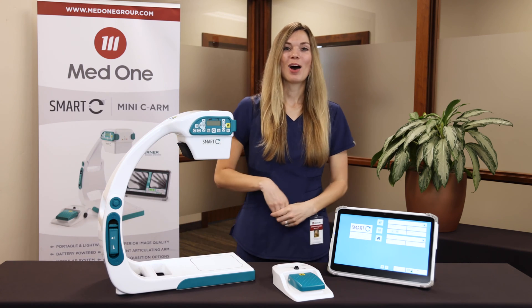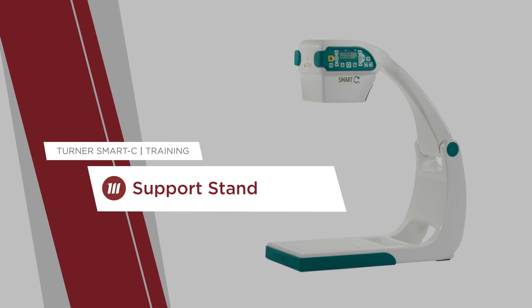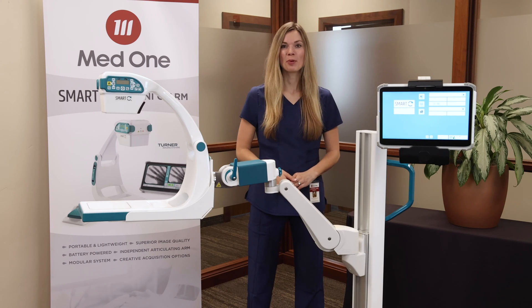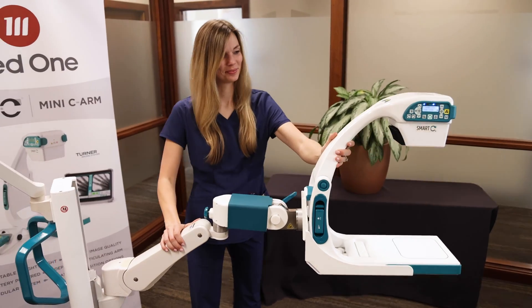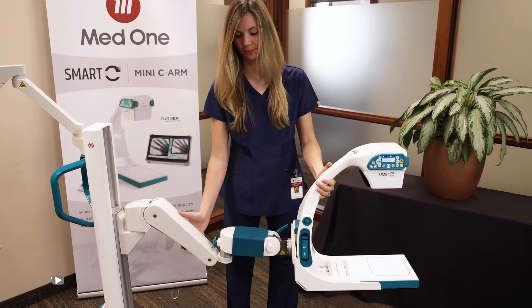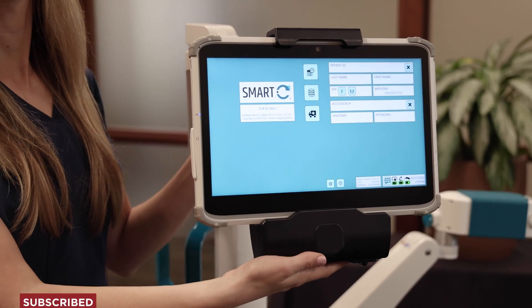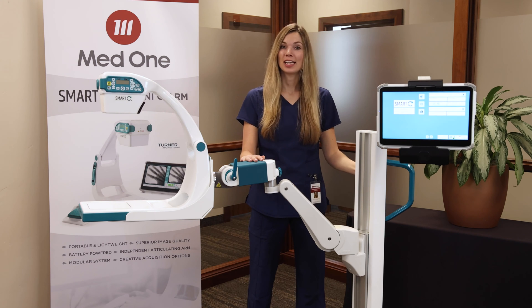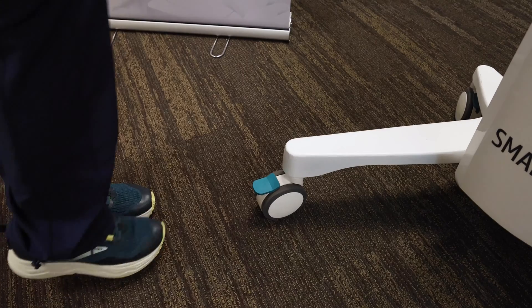Next, we're going to review the optional support stand and monitor cart. Here we have the optional support stand. It consists of a tray for your Smart-C, an arm that articulates 360 degrees for easy positioning, a tower with height adjustment, an optional tablet holder, a handle on the back for easy transportation, a place to store your foot pedal on the tower, and wheels that lock into place.